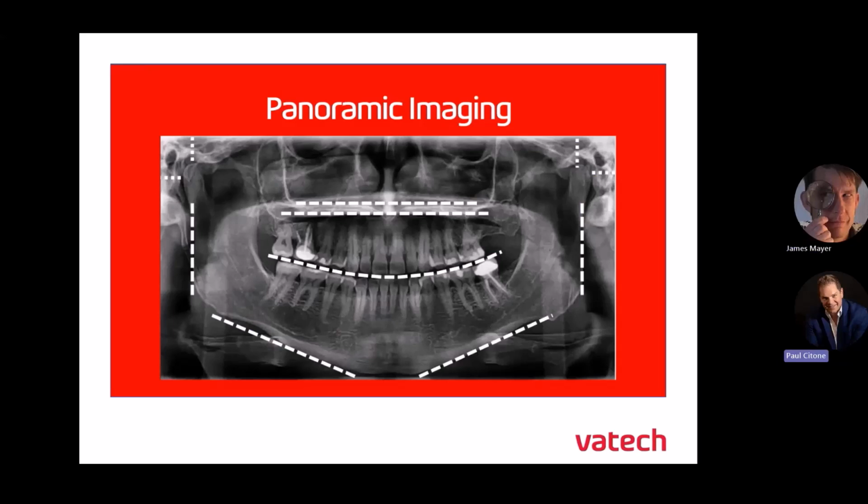We want a slight smile by having that 10-degree angle of the posterior teeth, which creates that slight smile you see there. The palate is nice and flat up there, designated by those white double lines. The condyles are even. One side's not tilted or larger than the other. And the chin there is in a slight slant position.